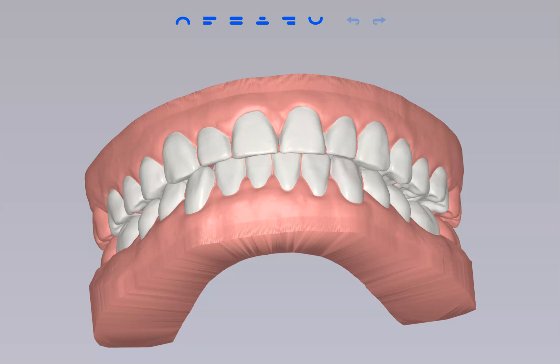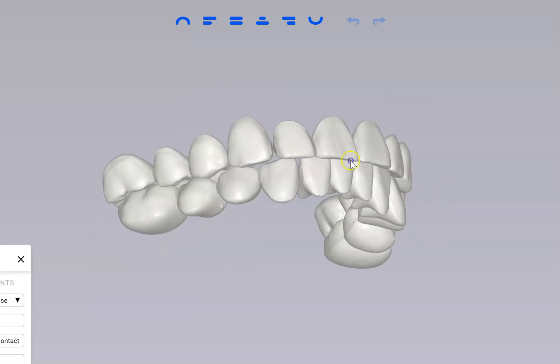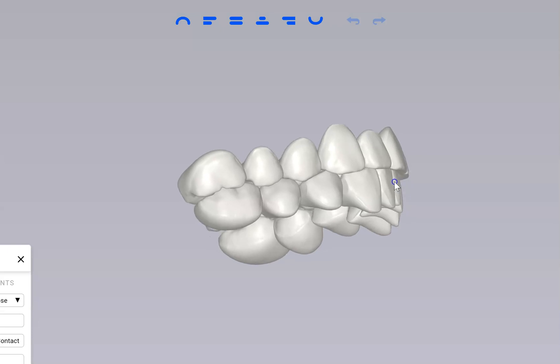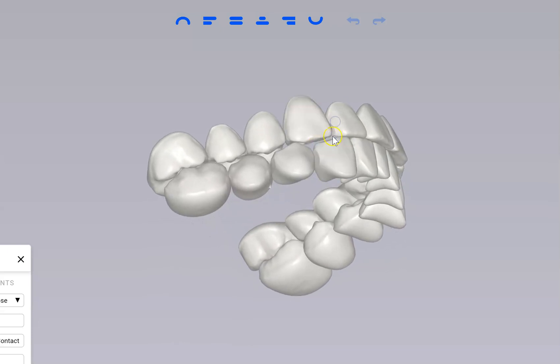So this is the initial position, and this is the final setup that we're going to do. We are creating a little bit of extra overjet — the upper front teeth are going to be a little bit in front of the lower front teeth, which is what we want. You can see there's a little bit of space right in there between those two teeth.